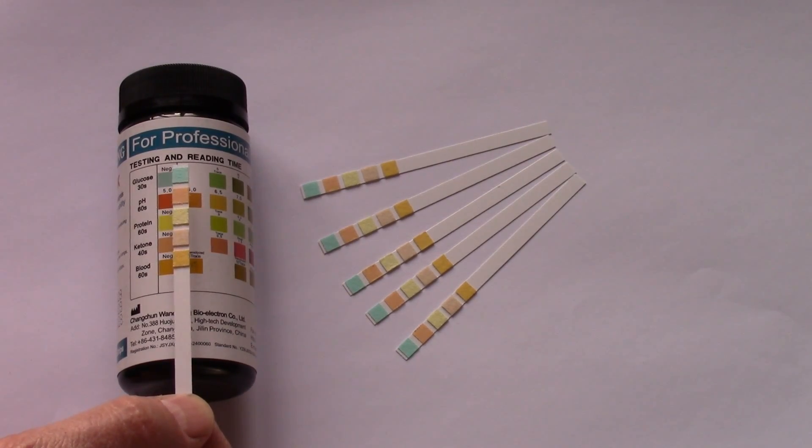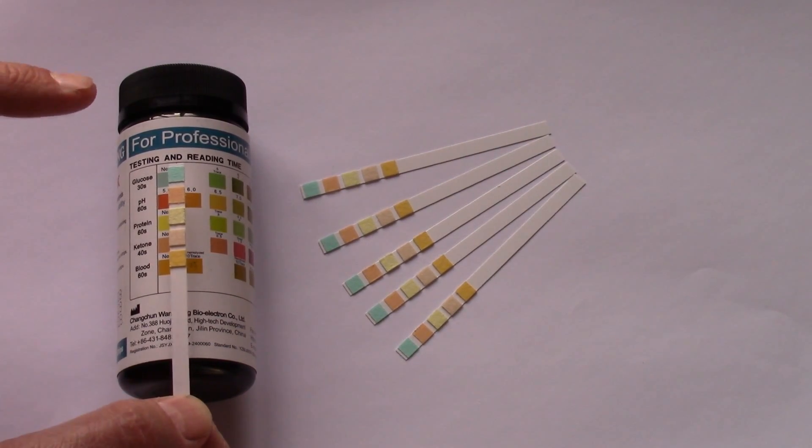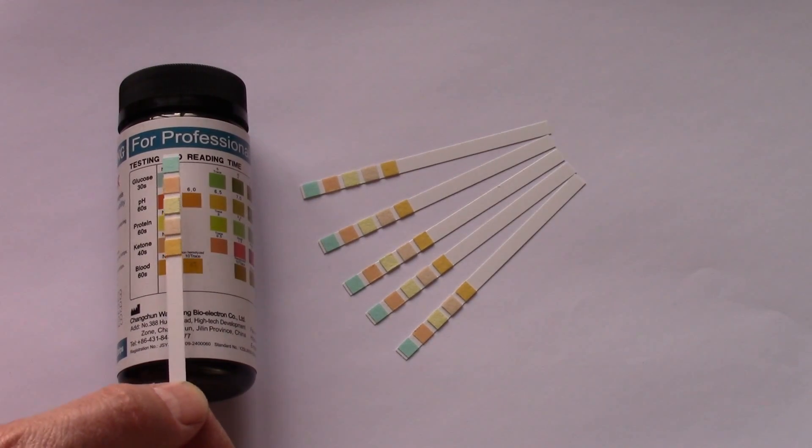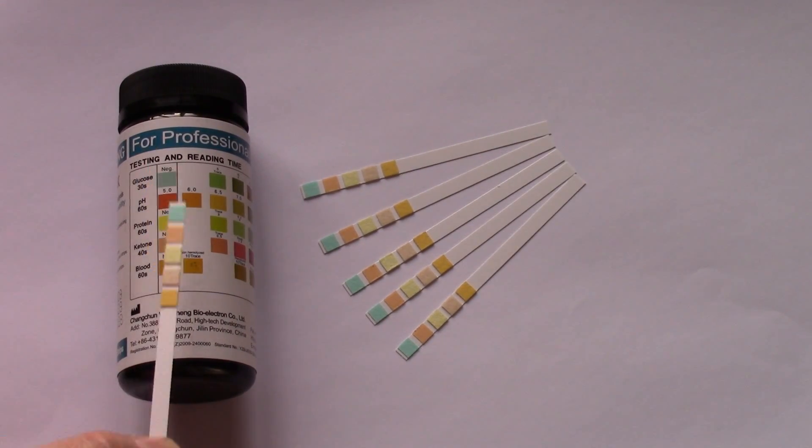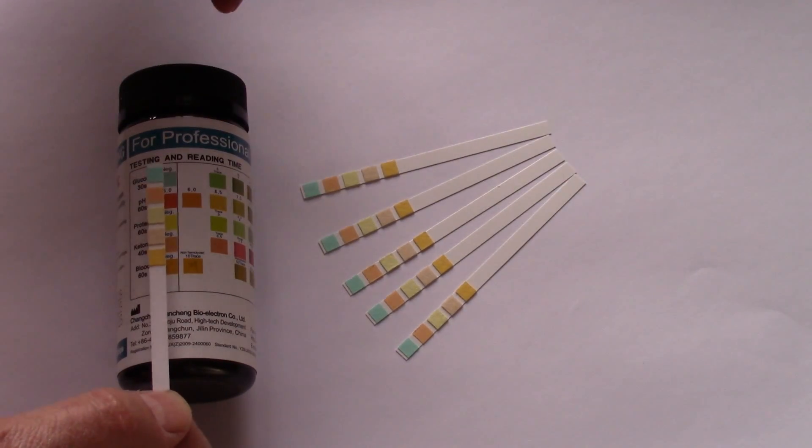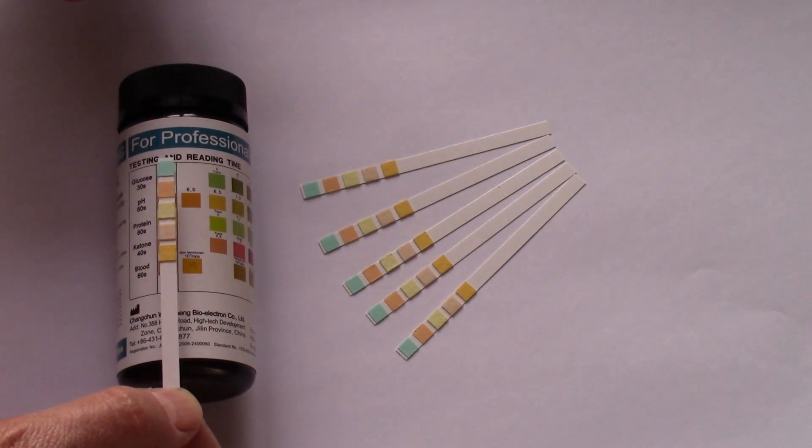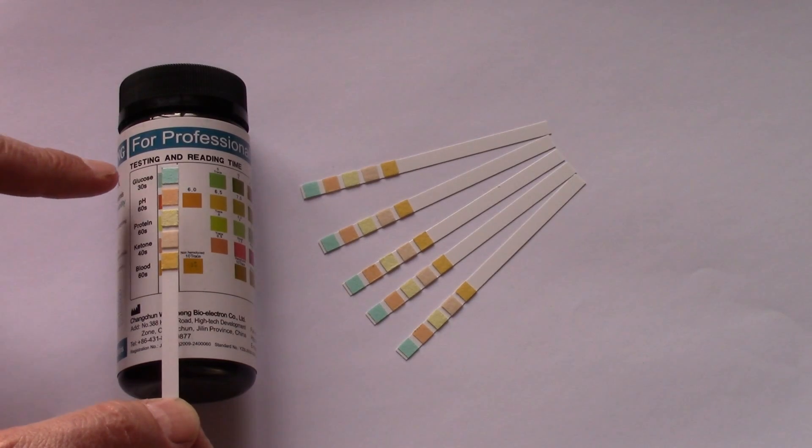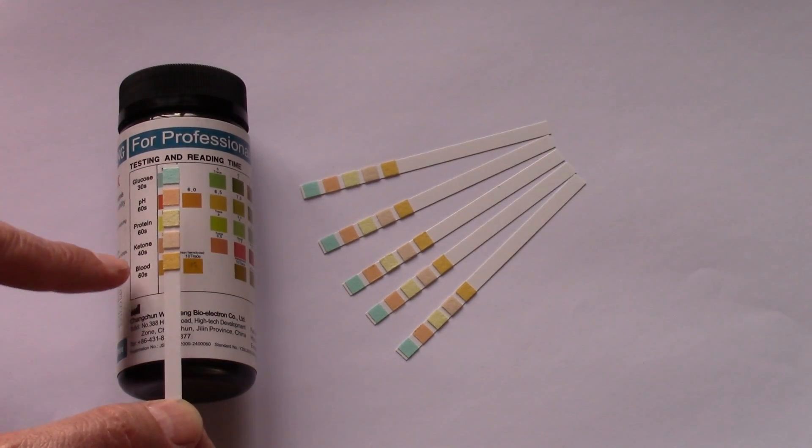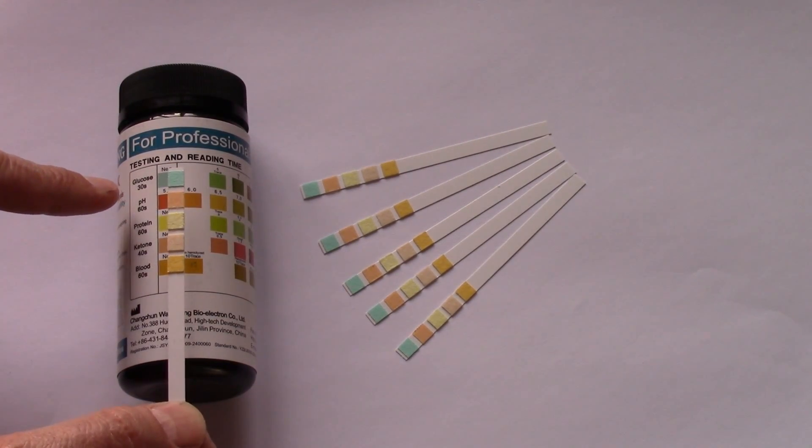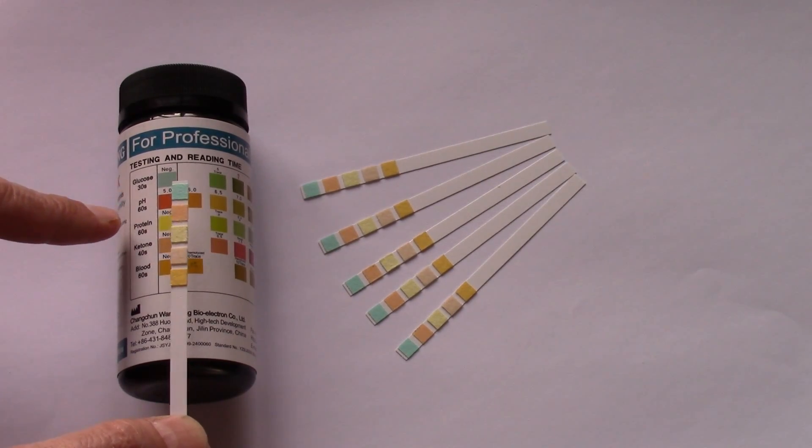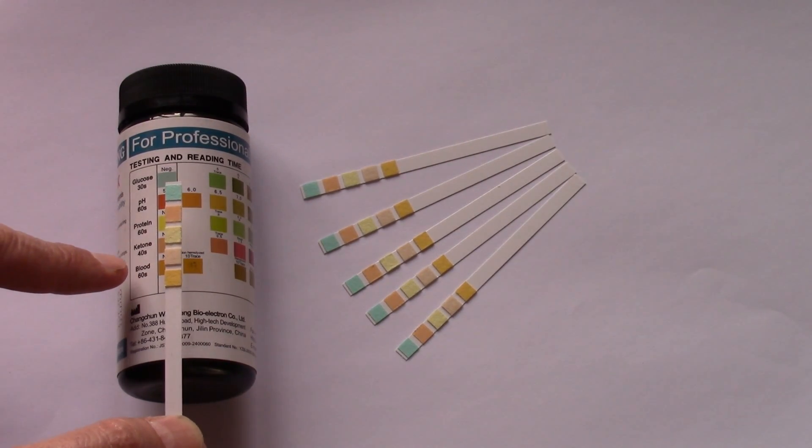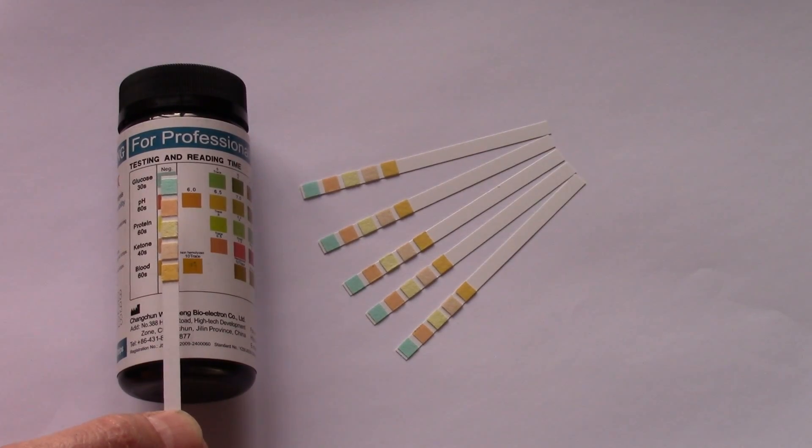The pad colors will darken slightly when they're wetted into the urine sample, but a full negative set of results should match that column indicated within the black linings. To indicate what levels of abnormalities you've detected, you have to look at these at the specific read times indicated next to the parameter. You're reading glucose at 30 seconds, pH, protein and blood at 60 seconds, and ketones at 40 seconds.